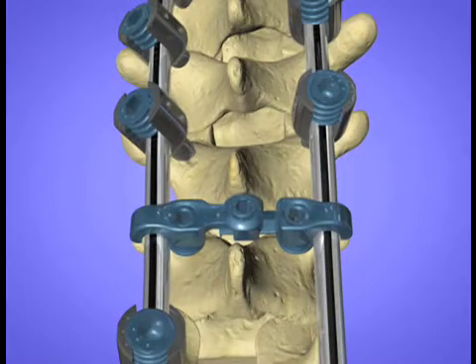The desired longitudinal rod position is verified, taking into account curve lengthening or shortening with correction. Stiffer curves require the use of rod rotation vice grips.